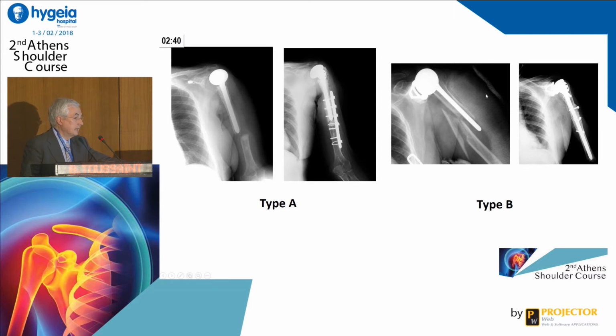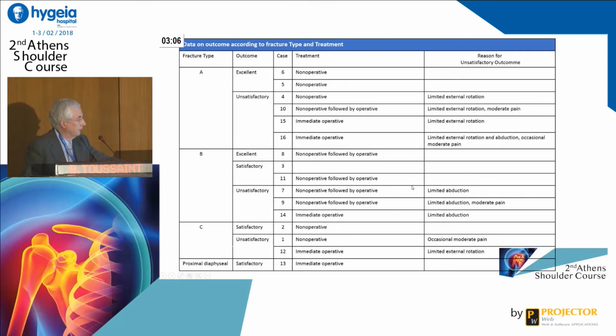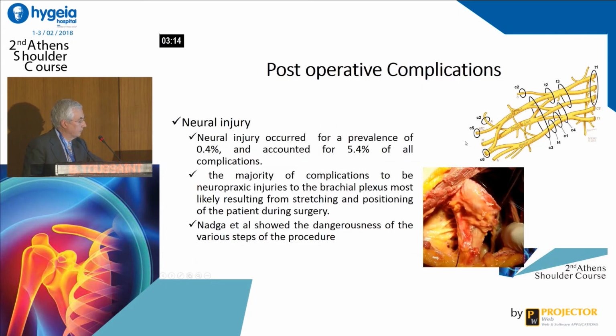For type B, you can use a long stem and fix and graft the fracture with bone, vascularized bone. Sometimes it's necessary to do. And for distal fractures, you can use a plate or orthopedic treatment. For the stemless prosthesis, it's easy to use orthopedic treatment to treat the fracture. It's a little bit more complex, and I go fast.